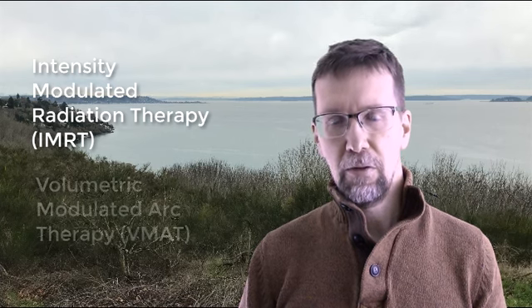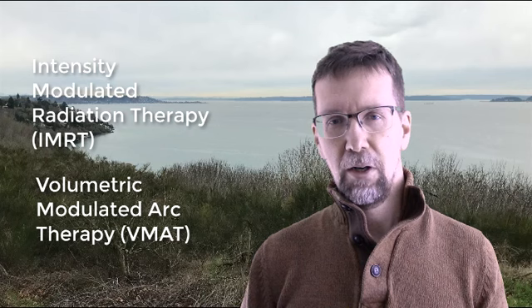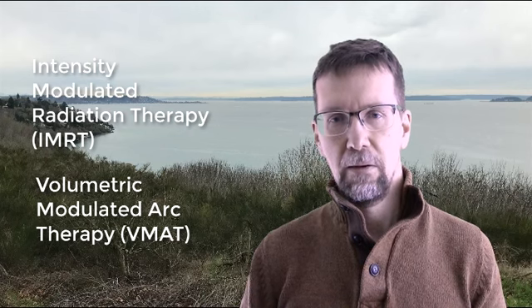Hello. In this video, I'm going to start to introduce the concepts of advanced treatment delivery using two techniques. The first is intensity modulated radiotherapy, IMRT, and the other closely related one is volumetric modulated arc therapy, VMAT. These are important delivery techniques because they allow you to conform a dose to a tumor and avoid doses to normal tissue, and I'll explain how that works, introduce the concepts.